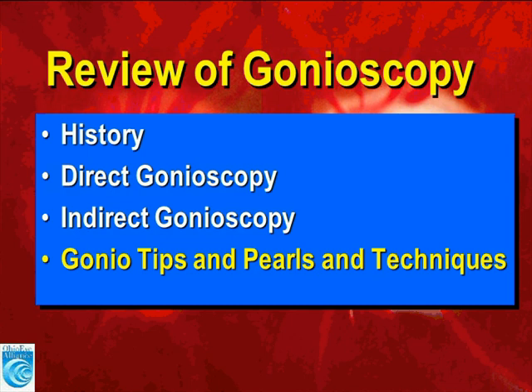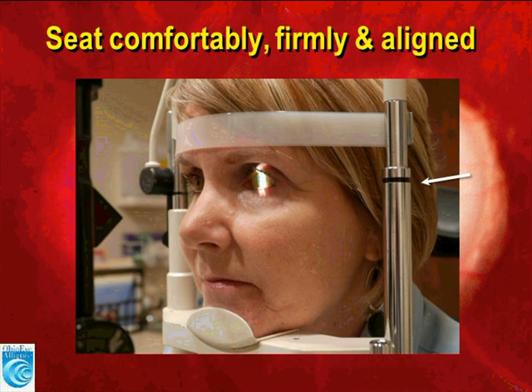Let's talk a little bit about performing gonioscopy and what residents and physicians can do in the office to make gonioscopy easier. Often this is a very stressful time for new residents learning gonioscopy. It's important not to make gonioscopy an ordeal. Gonioscopy should be very routine and part of your examination, and you should always have your gonio lens readily available, able to use at any moment while doing a slit lamp exam.